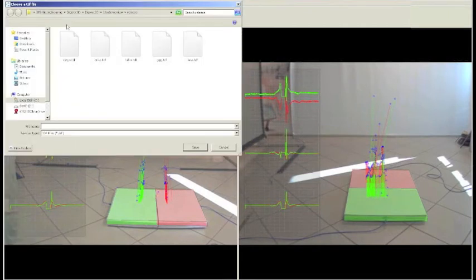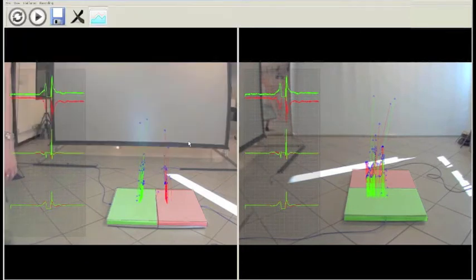We can decide to save the data, so we can type the name webinar BTS, save the data, and if we want, we can decide to make further analysis and analyze the data coming from this particular application. This is an application that, as a standalone application, is quite basic. I mean, it's thought to be applied in a condition in which I need to make a screening test, because I do not have any evaluation and any parameters or indexes coming from here.